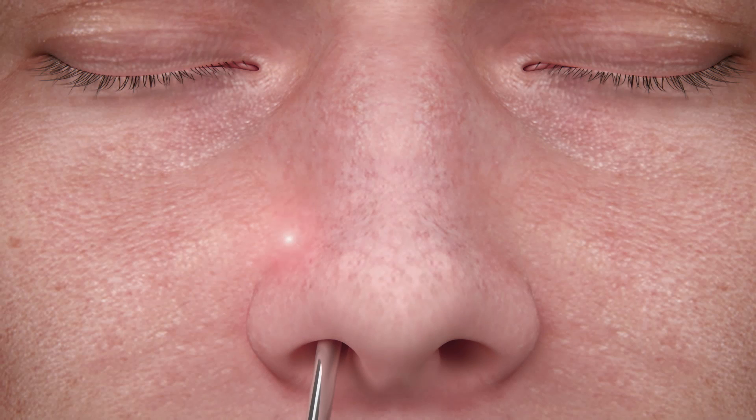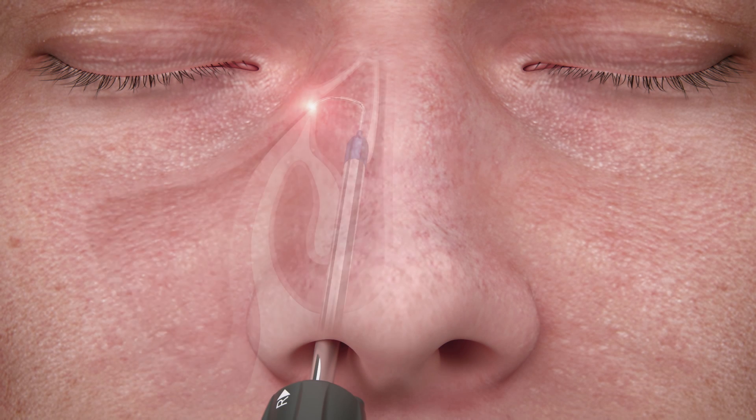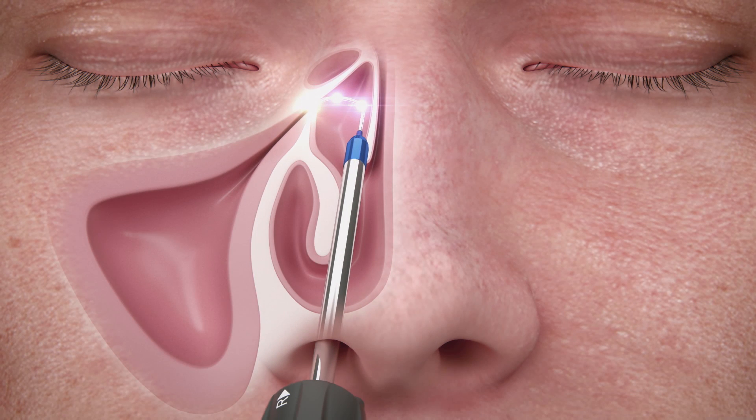Insert the distal end of the device into the nasal cavity. Endoscopic visible markers on the seeker-like tip can be used to facilitate positioning and palpate tissue to aid in access to the frontal or maxillary ostium. Advance the gray wire slider until the tip of the sinus illumination system is in the targeted sinus. Once placement is confirmed, gently advance the purple balloon slider. Visually confirm that the sinus balloon catheter has fully exited the balloon guard using the yellow-green marker at the proximal end of the balloon.